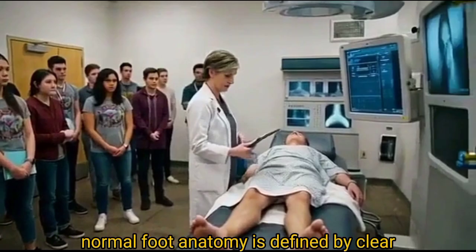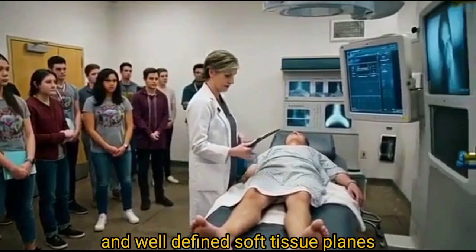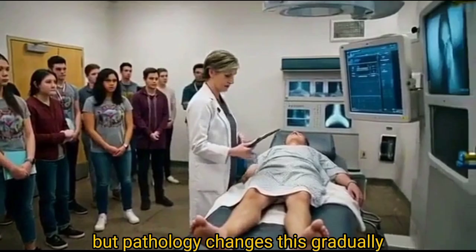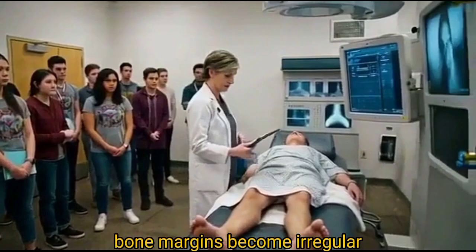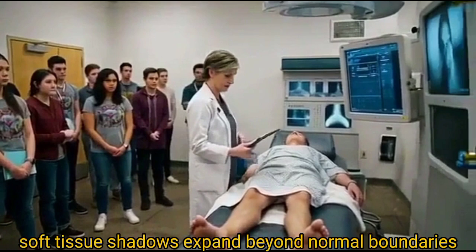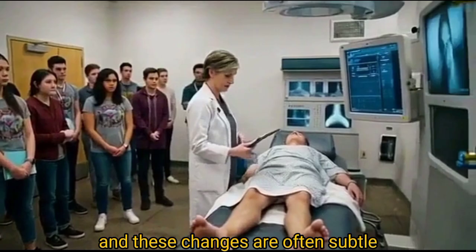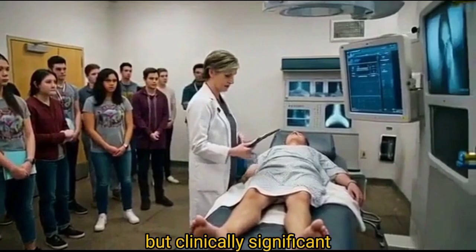Normal foot anatomy is defined by clear cortical margins, preserved joint spaces, and well-defined soft tissue planes. But pathology changes this gradually. Bone margins become irregular. Density becomes uneven. Soft tissue shadows expand beyond normal boundaries. And these changes are often subtle, but clinically significant.